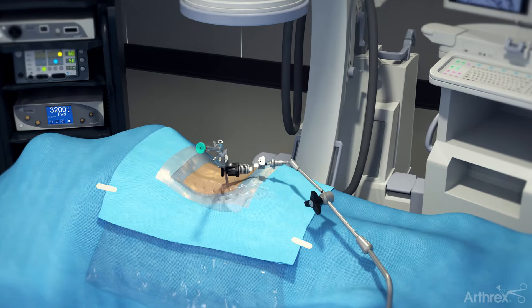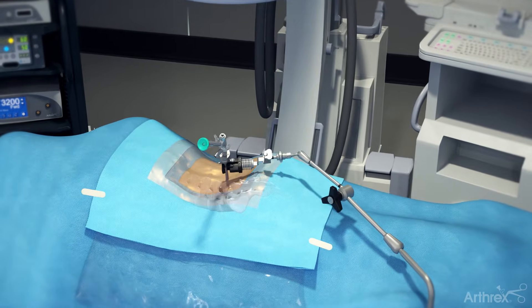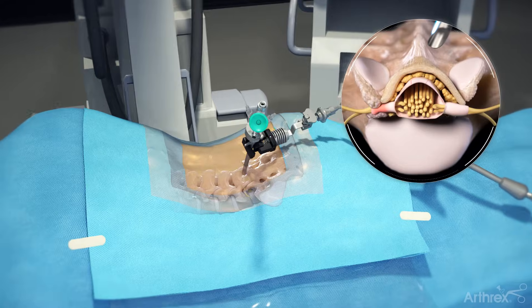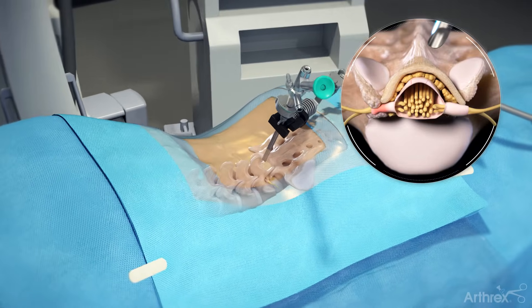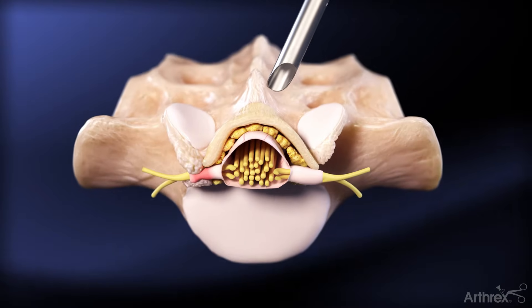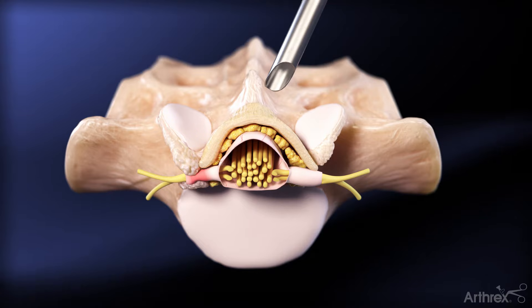Arthrex's lumbar unilateral laminotomy is an ultra-minimally invasive surgical approach for decompressions in patients who have been diagnosed with stenosis of the spinal canal or the spinal nerves. In this procedure, the endoscope is used to assist in the approach for access and visualization.